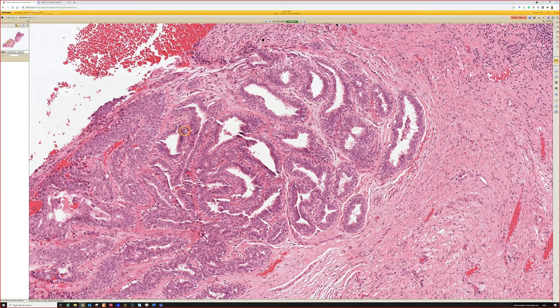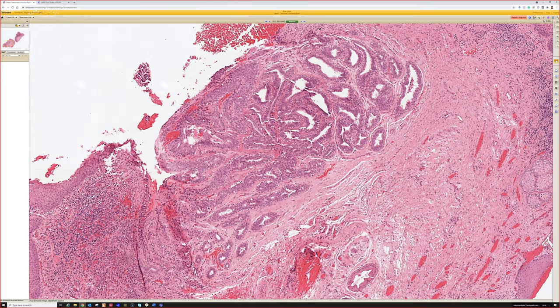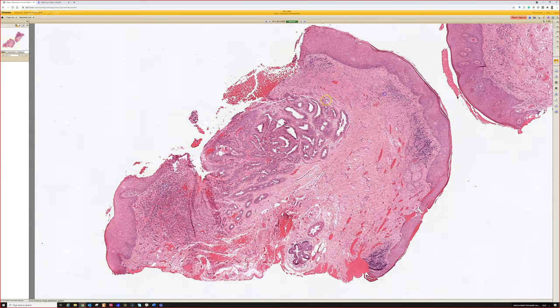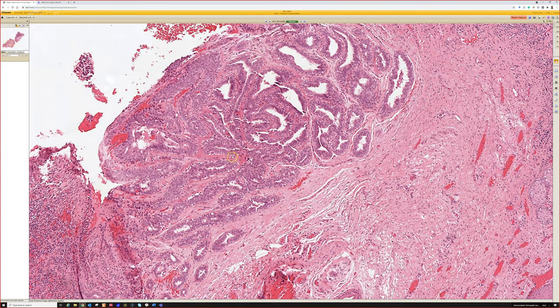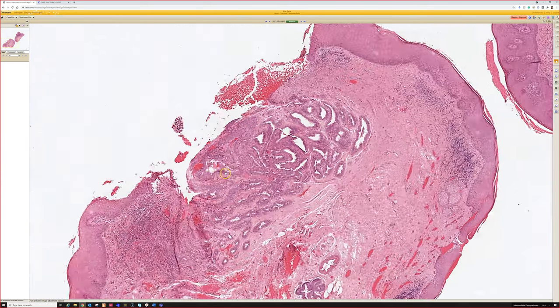And to me, even though they have the name Hidradenoma in them, they're not like a variation of regular Hidradenoma. They're a totally separate tumor, I think. They occur in different places. They look totally different. So Hidradenoma papilliferum. And if you see something like this on the nipple, then it would be a nipple adenoma or erosive adenomatosis. I feel like nipple adenomas can look very similar, have a lot of overlapping features with Hidradenoma papilliferum.